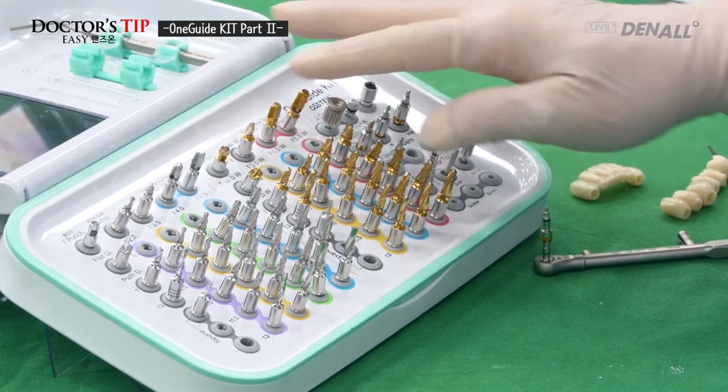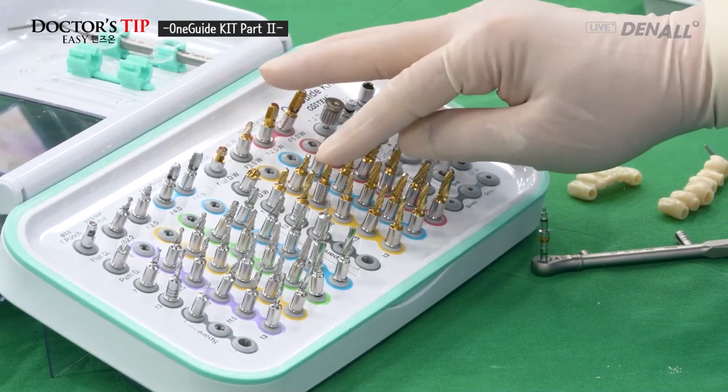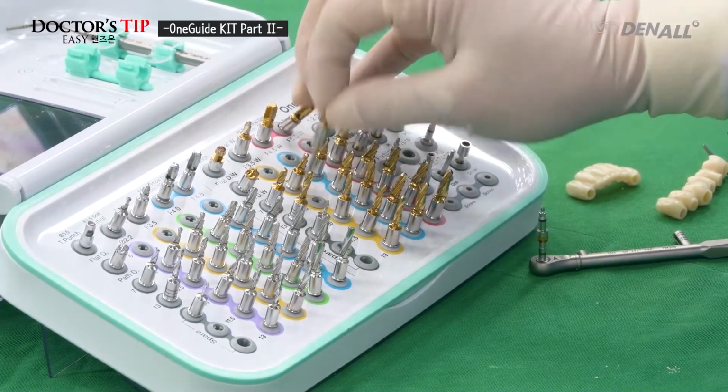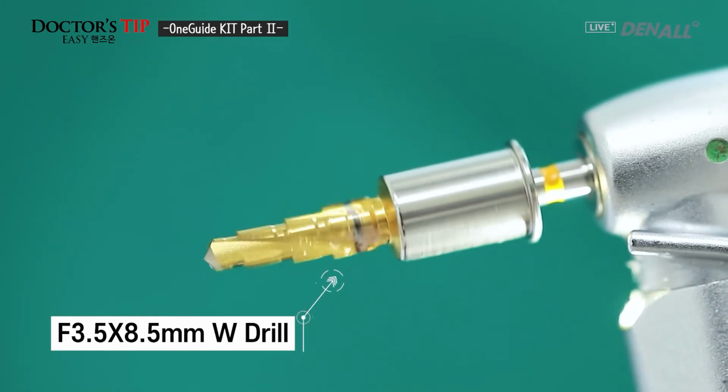To do full length drilling on accurate position, initial drilling is done, and after that, I'm going to drill 8.5 millimeter, 3.5 by 8.5 drill length. OneGuide drill is going to be chosen. It's connected.